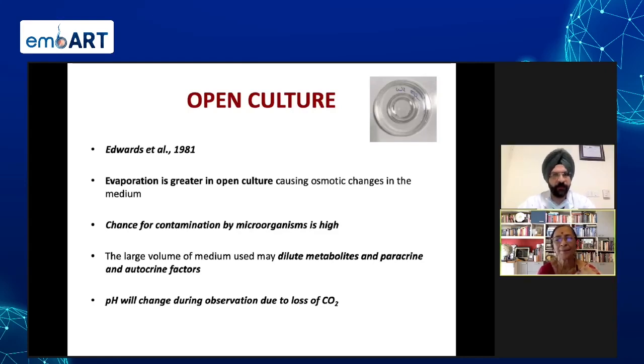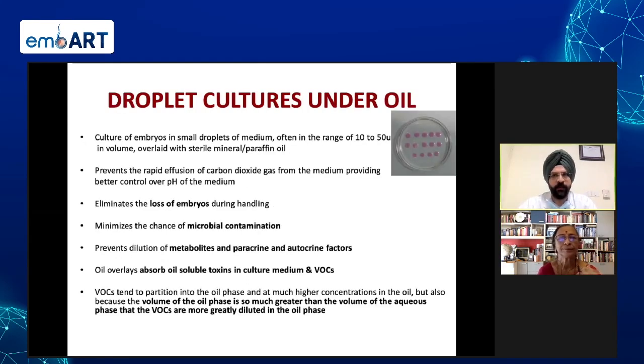Please. Just last slide. pH is going to change due to loss of CO2. If you look at embryo culture under oil, it eliminates loss of embryos during handling, minimizes the chances of microbial contamination, absorbs the VOCs, and maintains the metabolites and paracrine and autocrine factors.